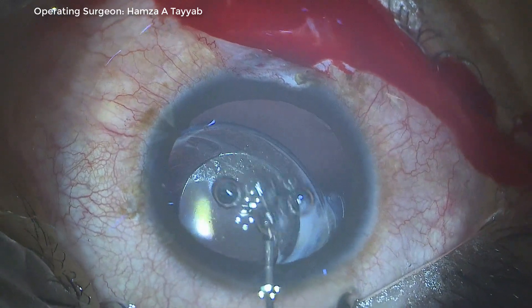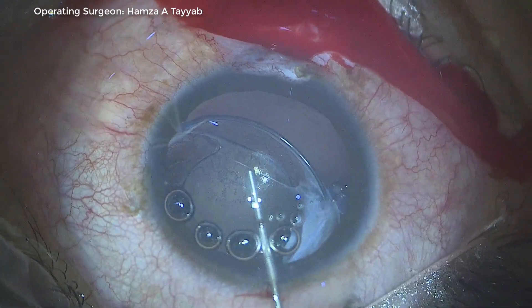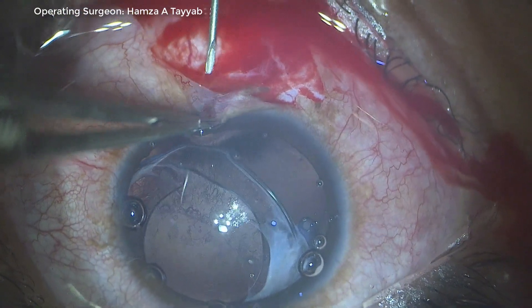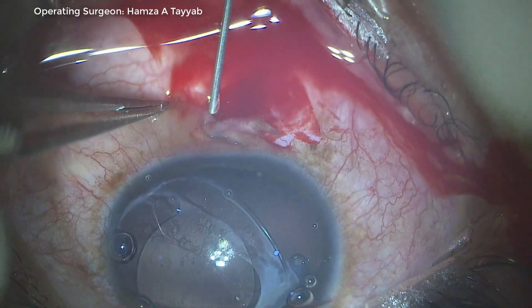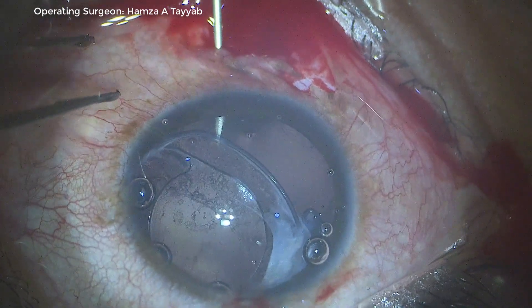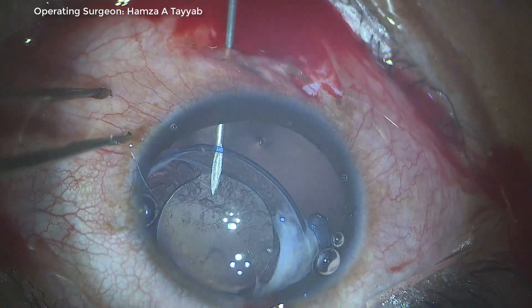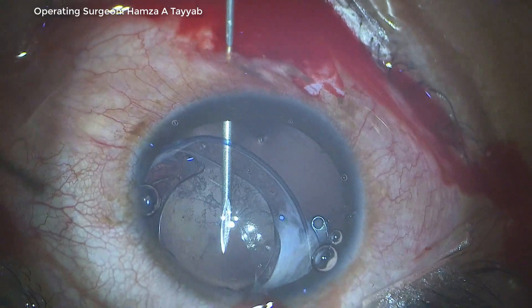I fill up the anterior chamber with a dispersive viscoelastic. Now I take a 26-gauge needle and pass it behind the iris. I have to make a small puncture in the capsular equator; however, since the bag is fibrosed, I'm not afraid of tearing it.